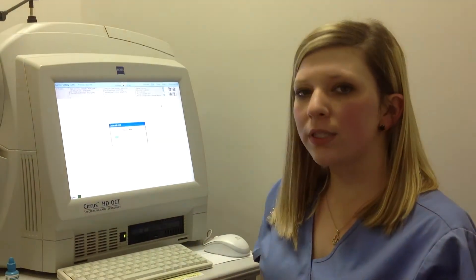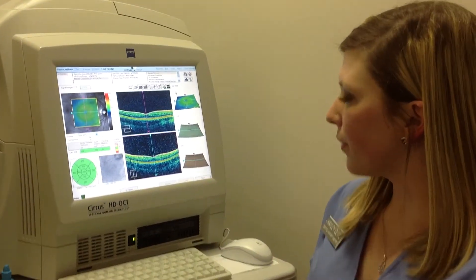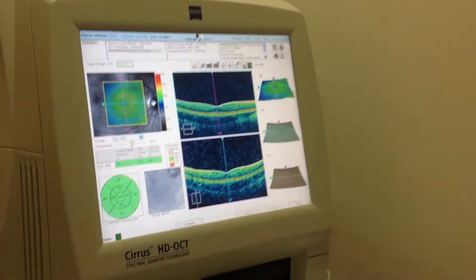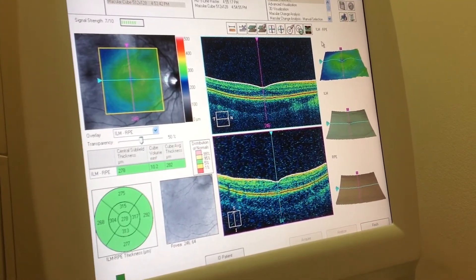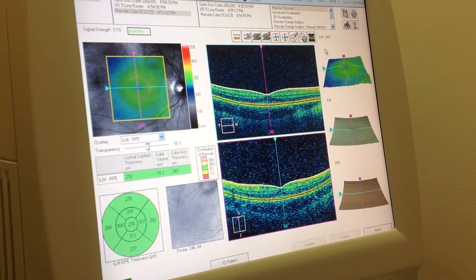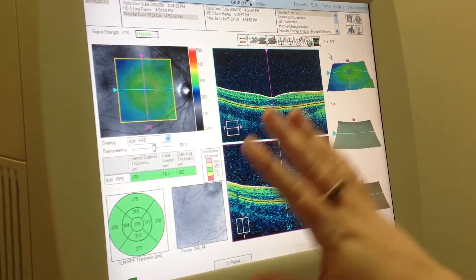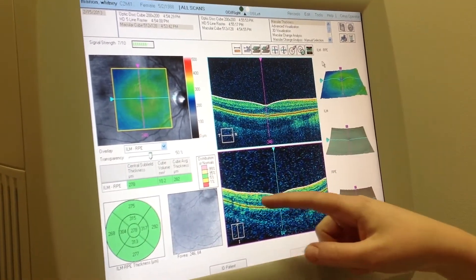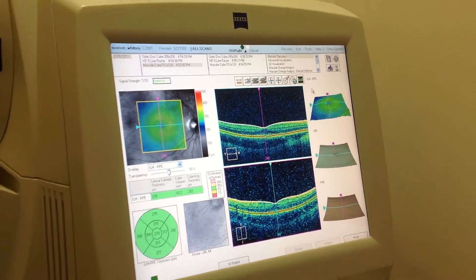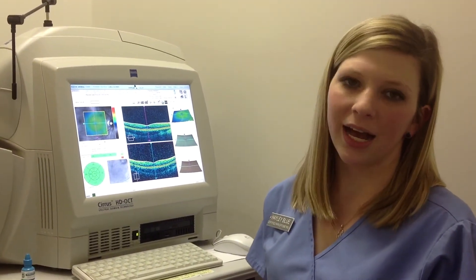For the macula, you want to do it one eye at a time, so the image looks a little bit different. We're focused on the center of the eye, which is your macula where you get your sharpest vision. As you can see, there's lots of green — green is good. We want it nice and smooth like this image is. If there were any bumps throughout here, then we would start to worry about macular degeneration. This machine is very helpful for monitoring and diagnosing any eye conditions.